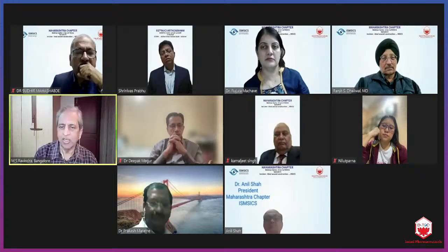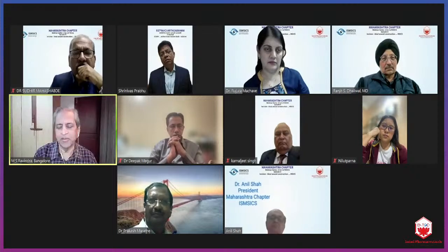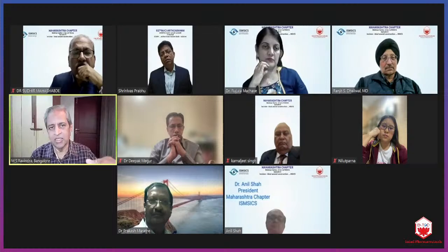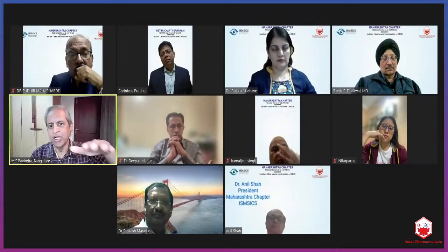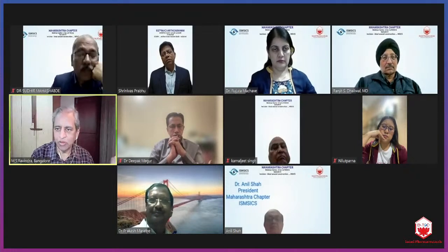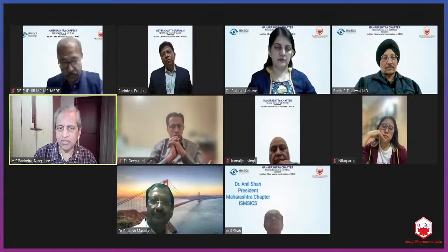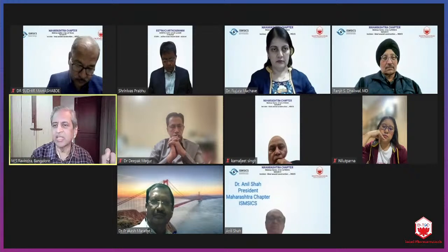See, even doing a tunnel, I have learned with great difficulty that the anterior thrust of the blade has to be minimum. You should use a wriggling movement to get a good position of the tunnel in the stroma. So you need to do a lot of surgeries just to learn a single point, and that you can hand over to a youngster if he is keen on learning.